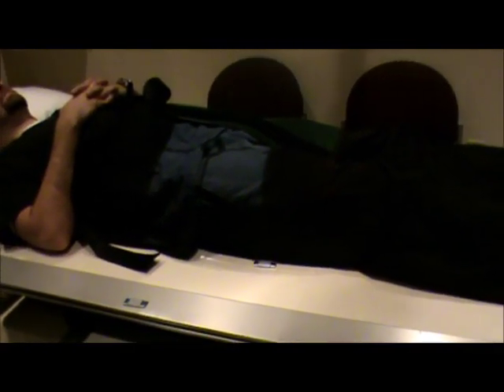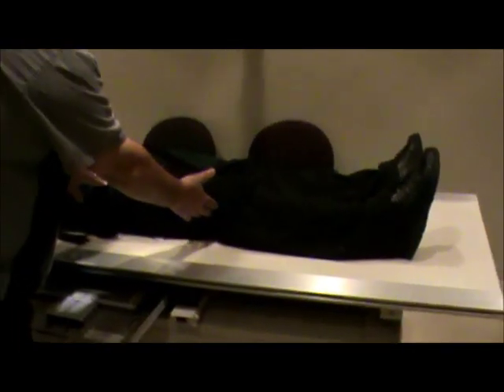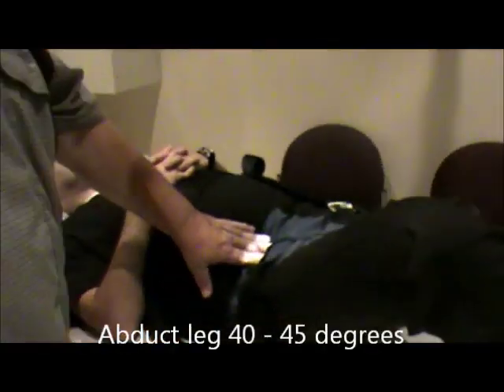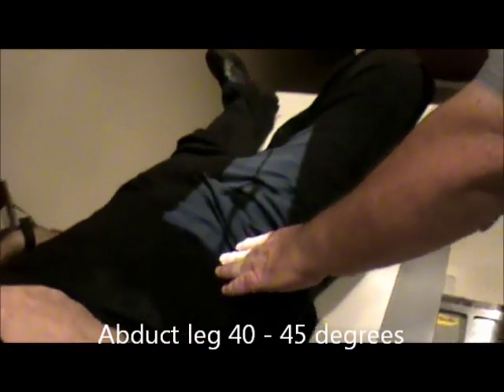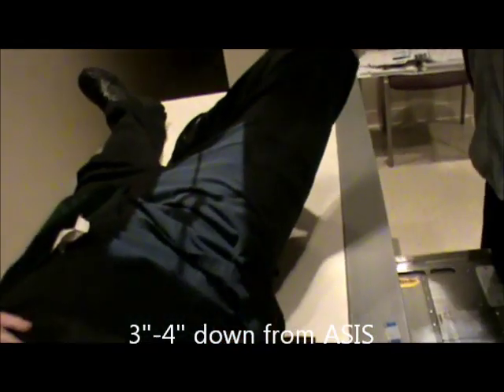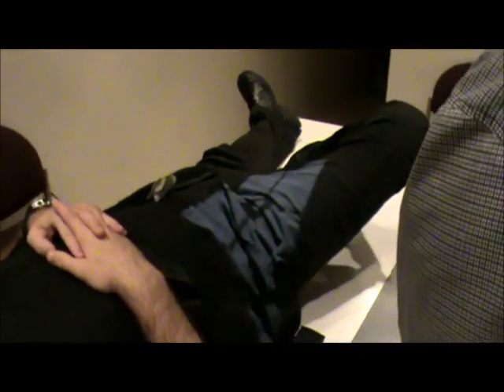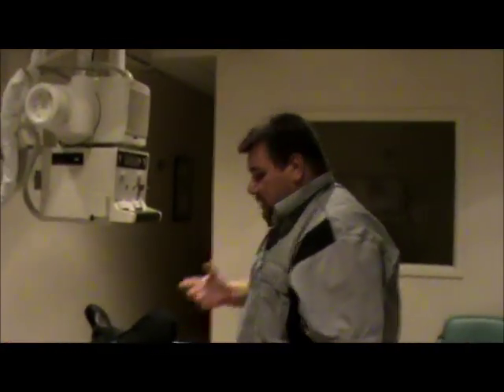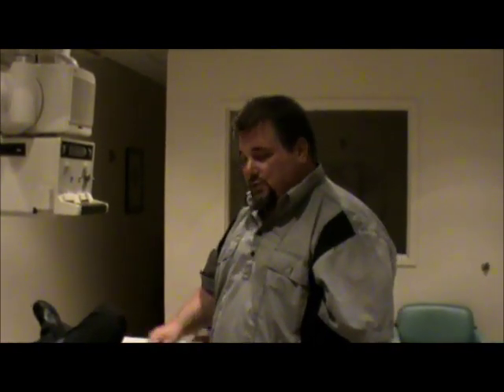We're going to go ahead and do the proximal frog leg, or modified Cleaves position for the hip. We're going to have the patient, if they can, bend their knee up and drop it out to the side about 40 to 45 degrees. Our centering again is going to be palpating the ASIS, and we're going to go three to four inches down, centered to the middle of the leg. We're getting more of the femur this way because we're actually getting the diagonal of the light field. We are going to have shielding to the opposite side. Film size remains the same, technical factors stay the same at about 77 to 81 kV. This will show the lesser trochanter in profile, so this would also be called the modified Cleaves or the frog leg.